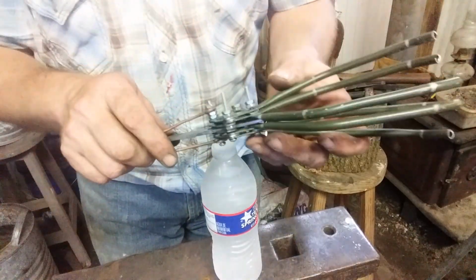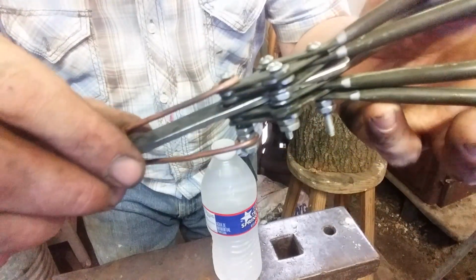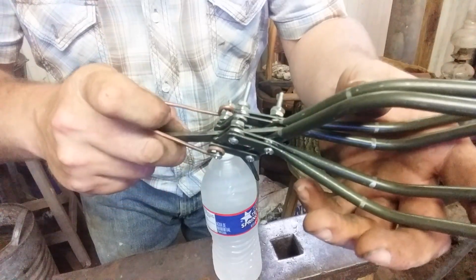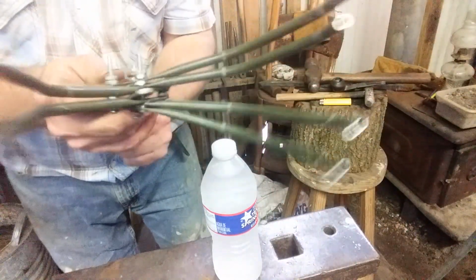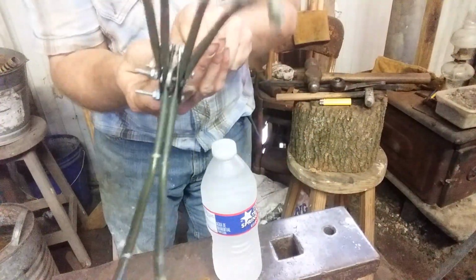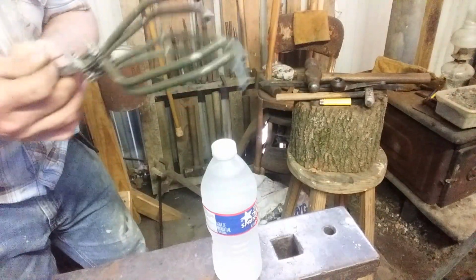Alright, I've kind of mocked this thing up with some nuts and bolts and the little pieces that we made. And I put a little piece of copper wire on it so I can try to actuate it. And that's kind of uncomfortable in the palm right now. This is just an idea. It moves really easily. Is that not creepy a little bit? I'm actually kind of pleased with how this is turning out. There's a bottle of water.